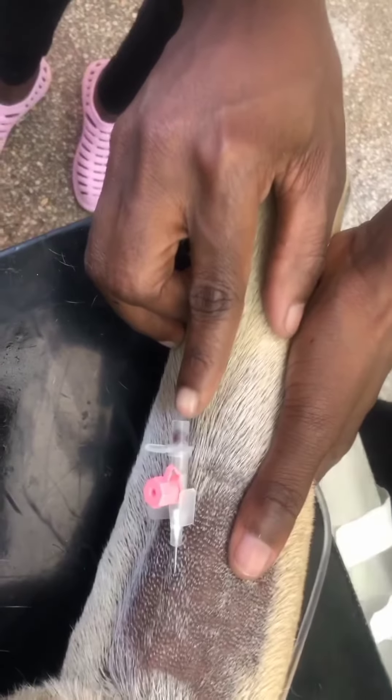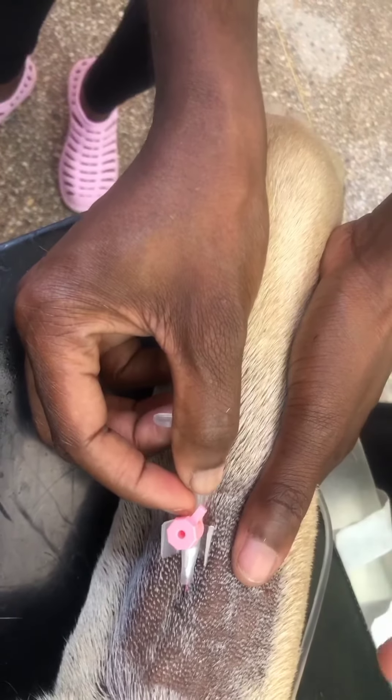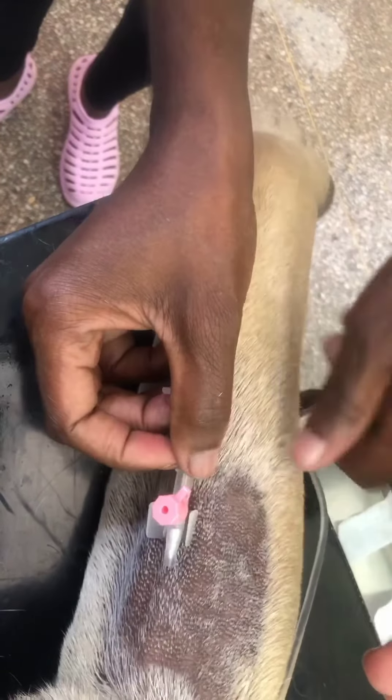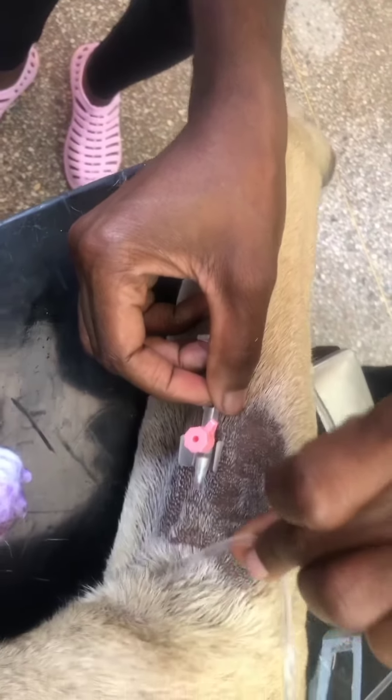Others will go over the vein. Once you see blood there, that means you're in. You push in the plastic while you pull out the needle.